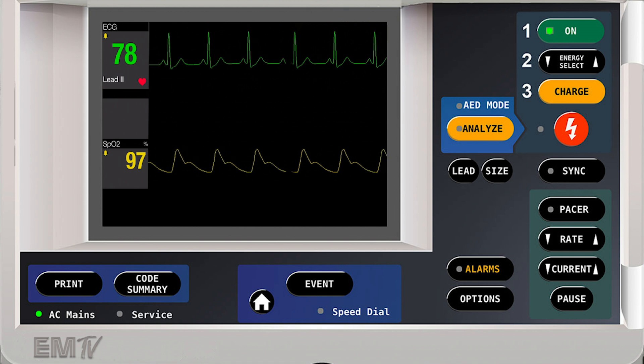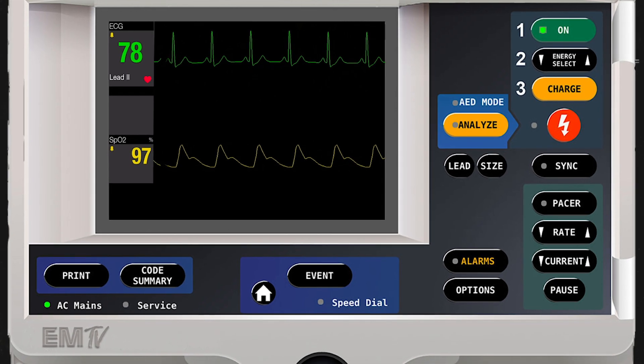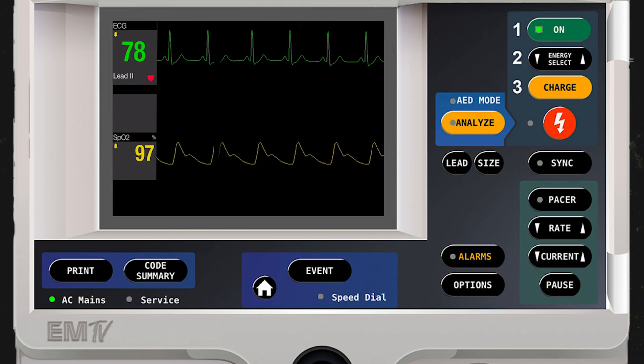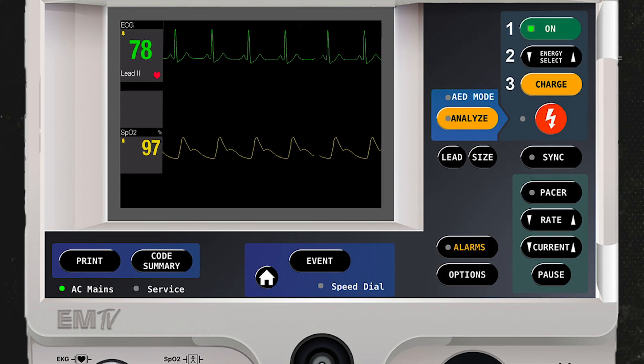Now just remember, because these patients are alive, this may be a very painful procedure. So consider pre-medicating appropriately.